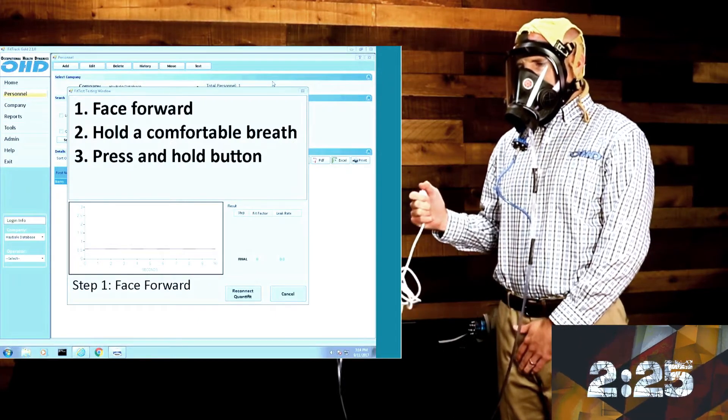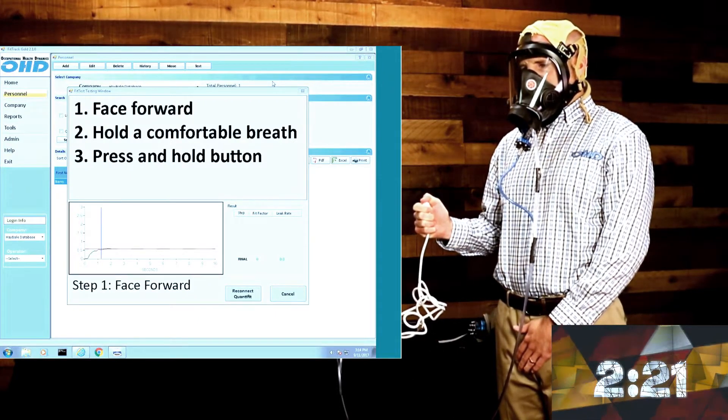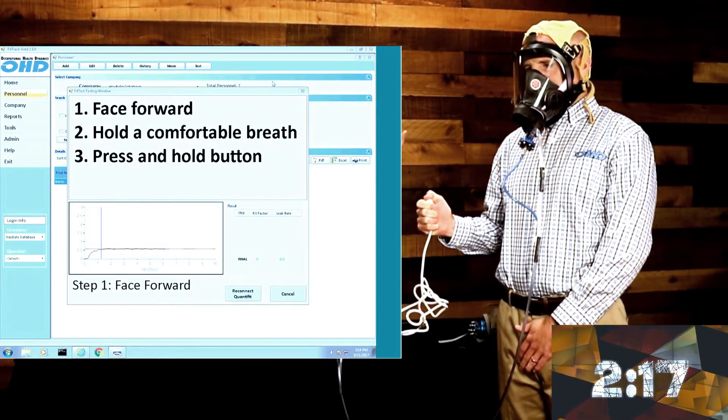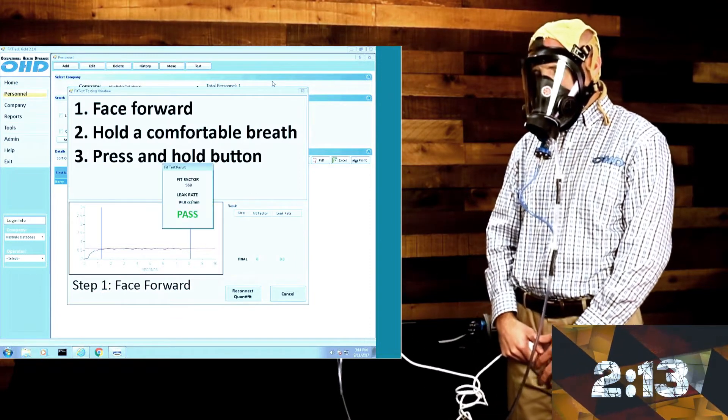Booth is now engaging the first step. Through step one, we're pulling the air out of the mask and measuring how much air leaks into the face piece right now through this step. The Quantifit has already finished step one, and the screen shows us a pass.